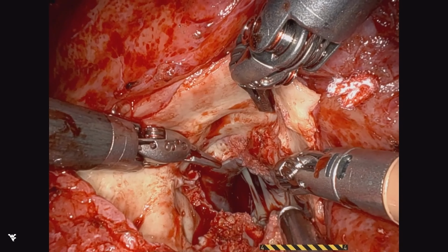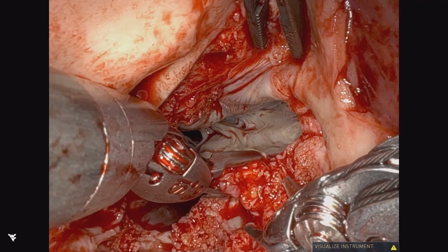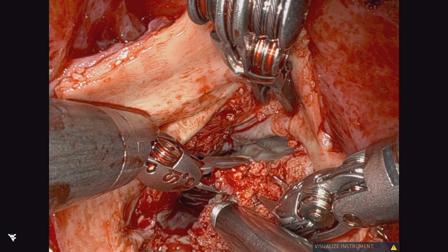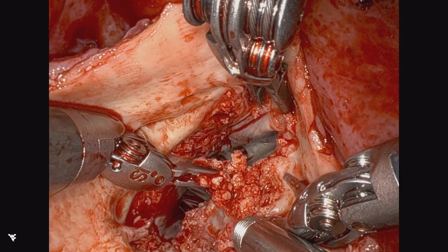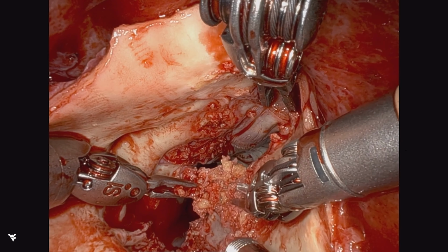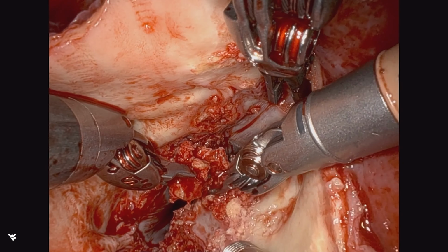I've been fairly aggressive over there, but this at the level of the right is relatively safe away from the right coronary ostia. So now we're going to focus on the mitral valve, this big sort of another stalactite sort of descending down onto the posterior surface of the anterior leaflet of the mitral valve. It can cause not only obstruction in the outflow tract of the aortic valve, but also restriction of movement of the anterior leaflet.